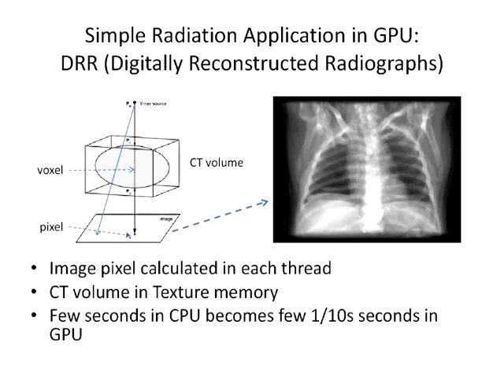Of course, in the GPU application, we could use a special texture memory in the GPU, and the three-dimensional texture memory was used to store the CT volume.